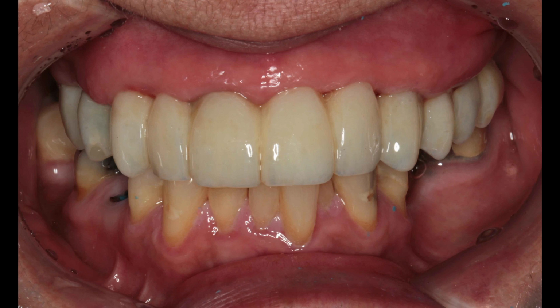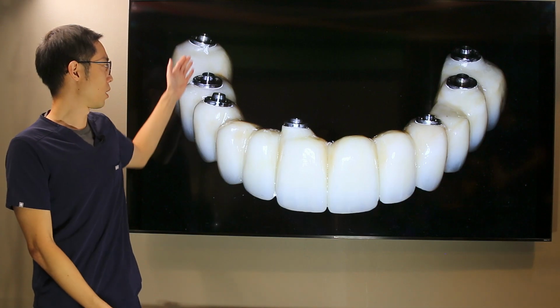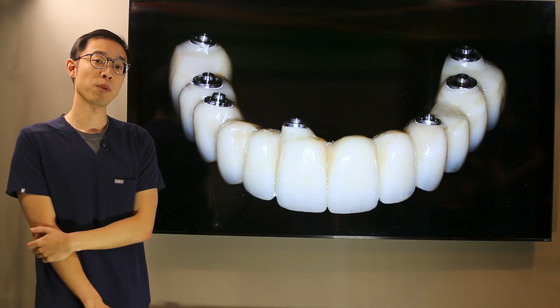After more healing, at this stage, we are ready for the impressions of the implants and moving on to the definitive restorations. So over here, you can see the definitive restoration, which is high-strength ceramic zirconia, and these are all cemented onto titanium cylinders that are going to be placed on the implant.